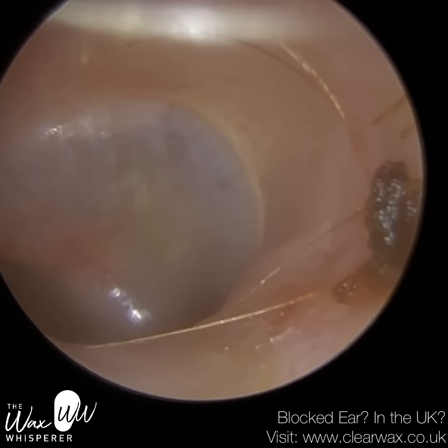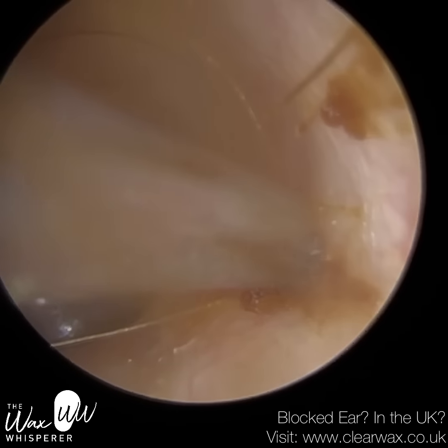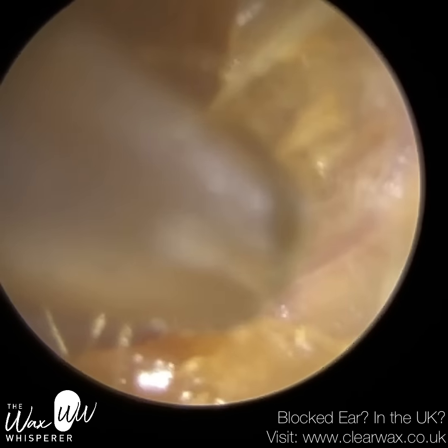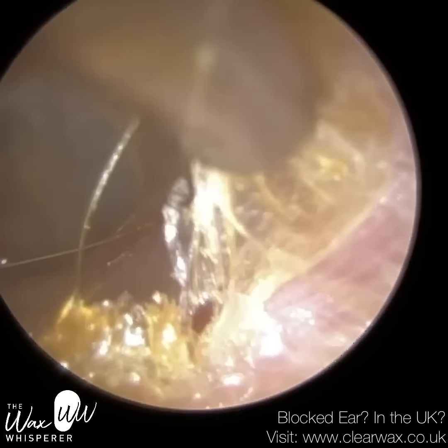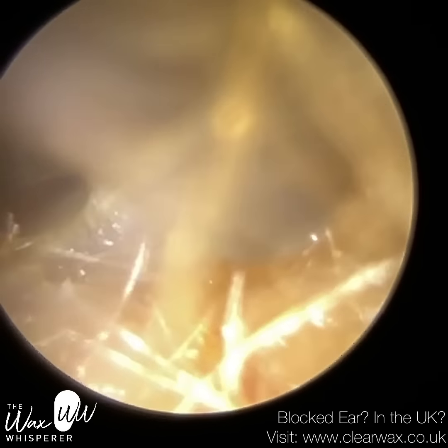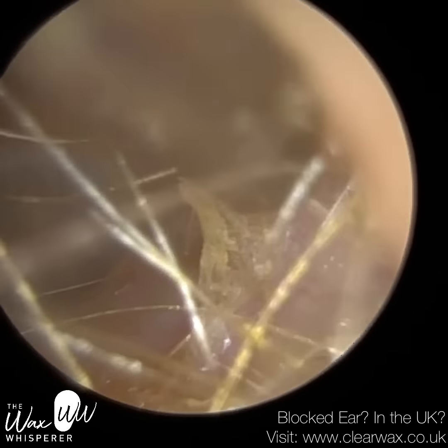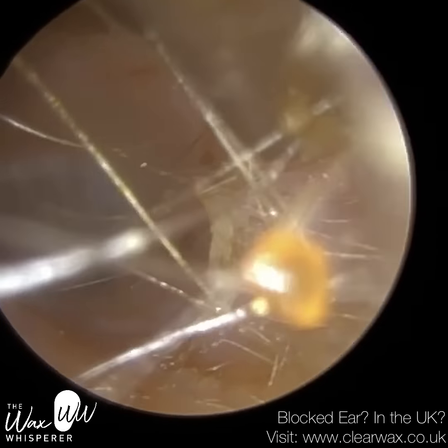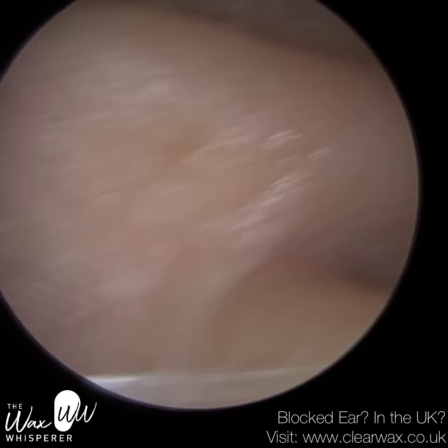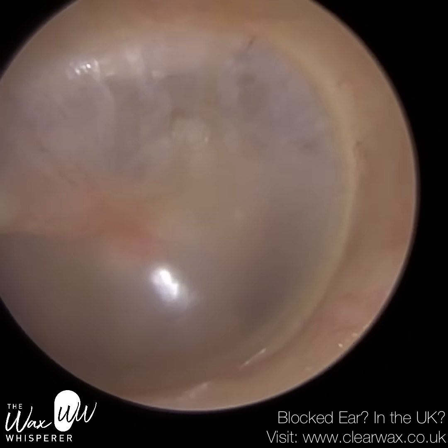Hair strand follicles should only be located on the outer third of the ear canal. When you approach the osseous portion — the bony part of the ear canal — there shouldn't be any hair follicles, so you shouldn't see any hairs extending out. The reason why I'm removing this skin is that sometimes there can be unpleasant surprises, such as a canal cholesteatoma hiding underneath the skin, or some exposed or eroded bone. So I do like removing some of this skin at the floor of the ear canal, especially just to check if there's anything hidden away that needs further investigation or treatment. Fortunately in this case, underneath that blanket of skin, the ear canal was fine and healthy.